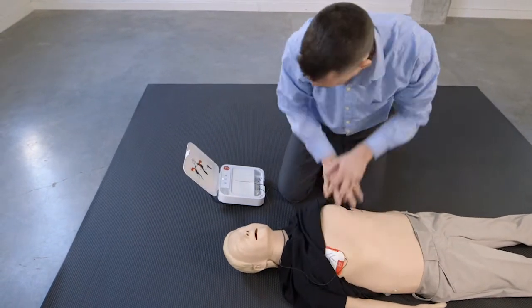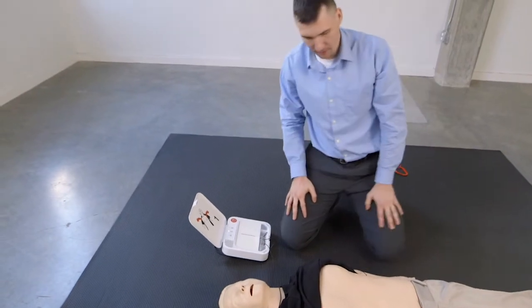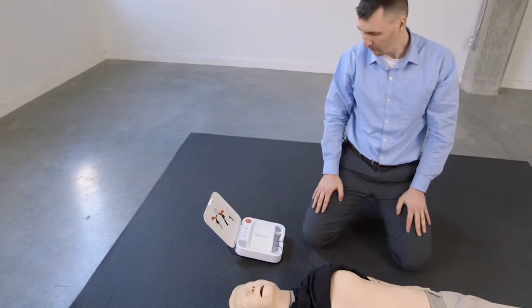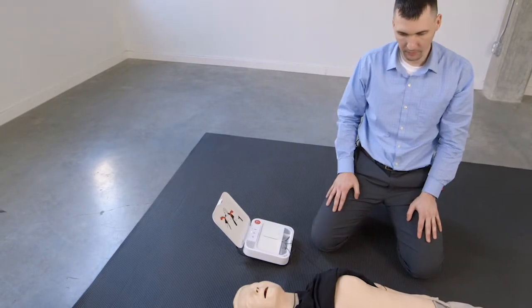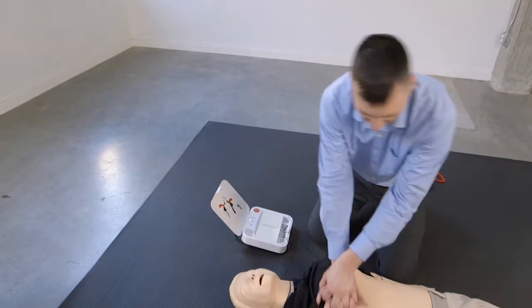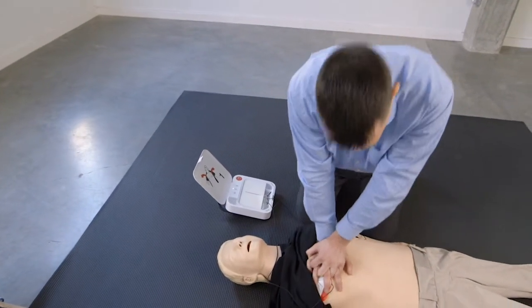Stop chest compressions. Everyone clear. Press flashing button. Shock delivered. Resume chest compressions. Push down hard at least five centimetres.